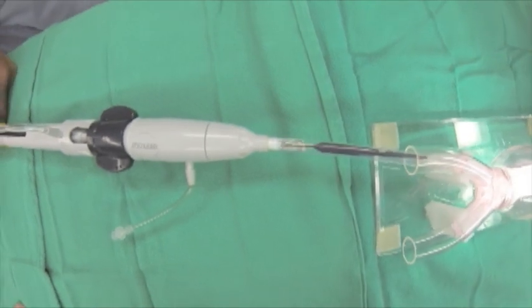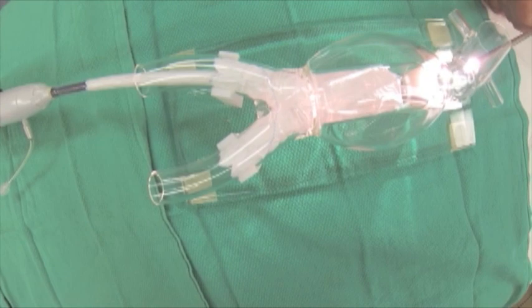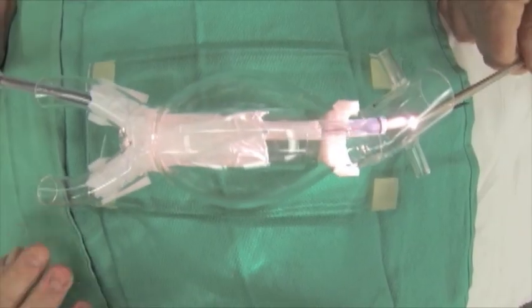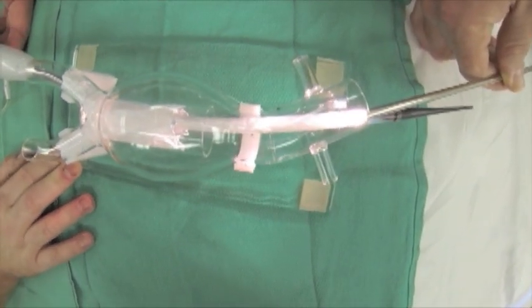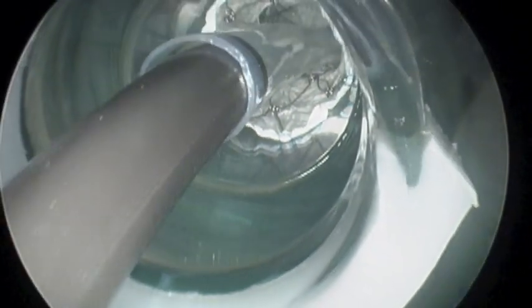The proximal extension graft is now being placed, going through the sheath and proximally into the plastic model. This is where you will want to get an angiogram in order to delineate the renal arteries. Here's a view from the inside — the proximal extension is being placed and positioned.